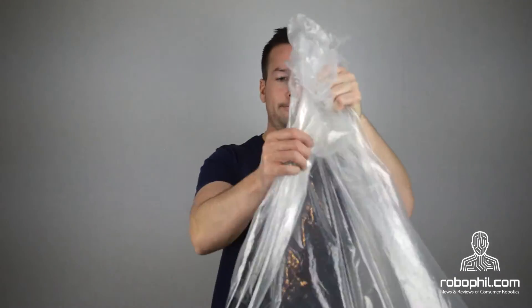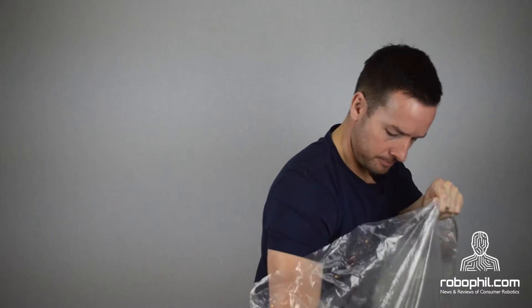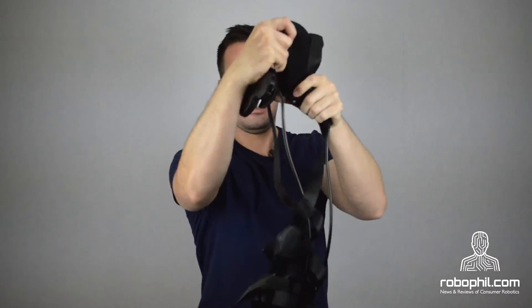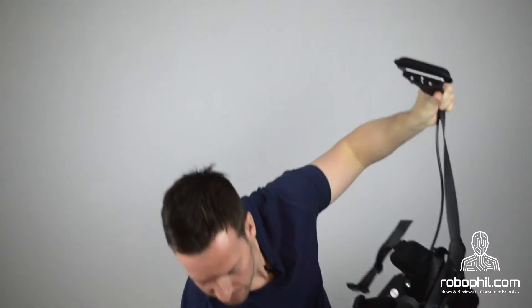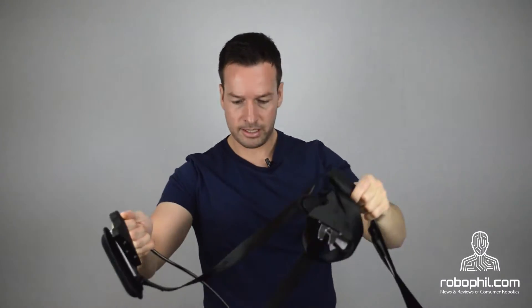Right guys, now on to the unboxing — or this time, an un-bagging. So let's take it out. This is a one-piece unit.